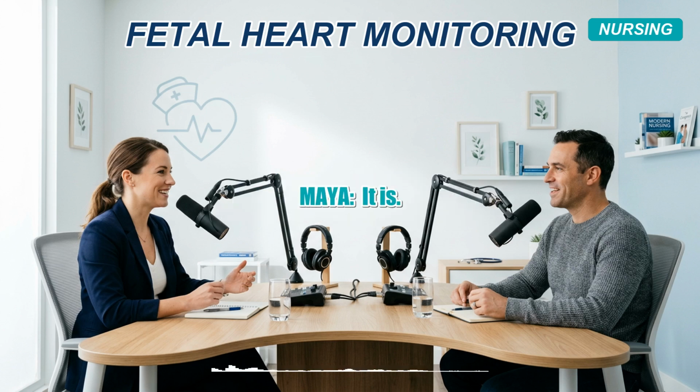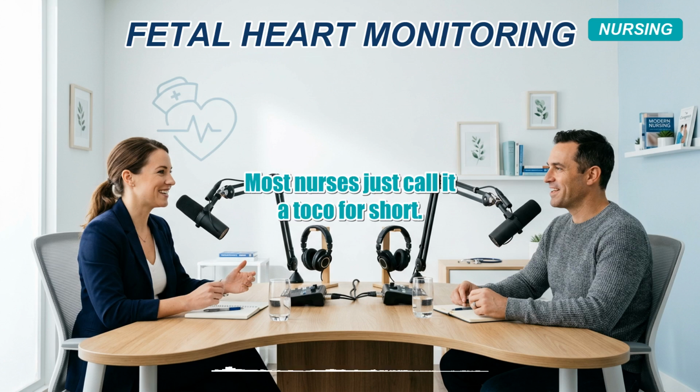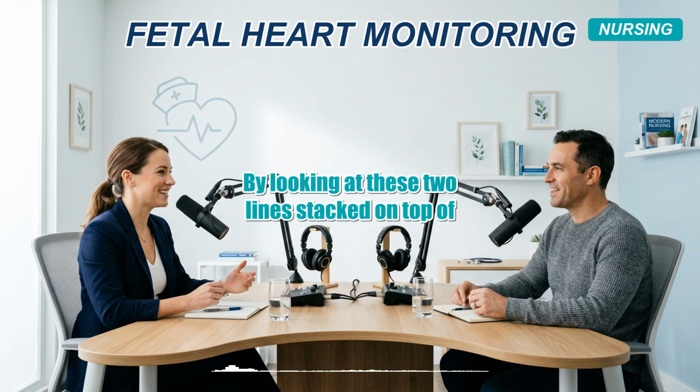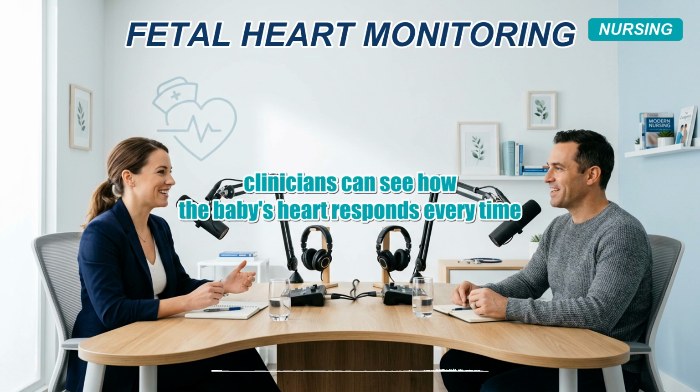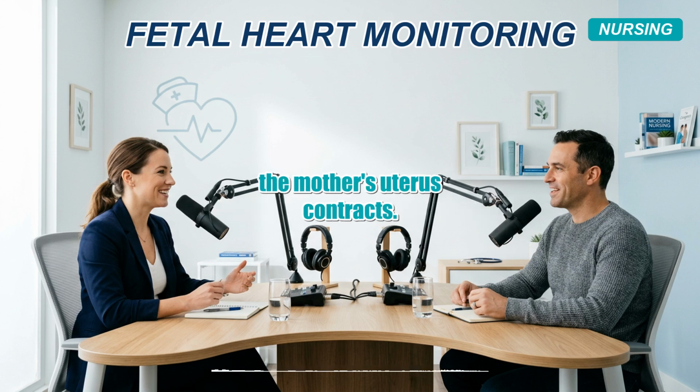That's a mouthful. It is. Most nurses just call it a toco for short. By looking at these two lines stacked on top of each other, clinicians can see how the baby's heart responds every time the mother's uterus contracts.